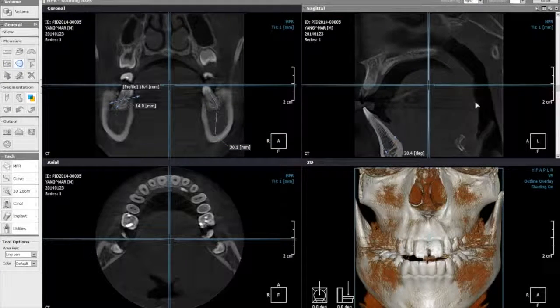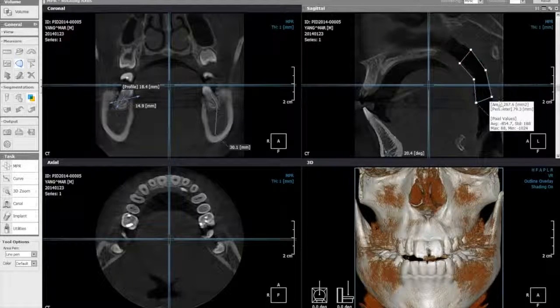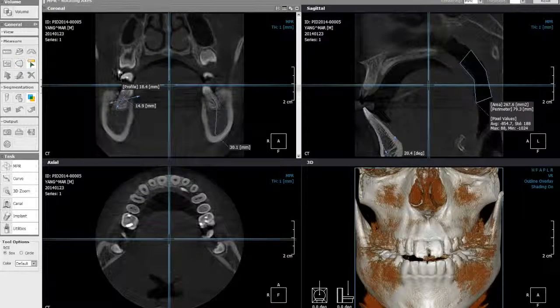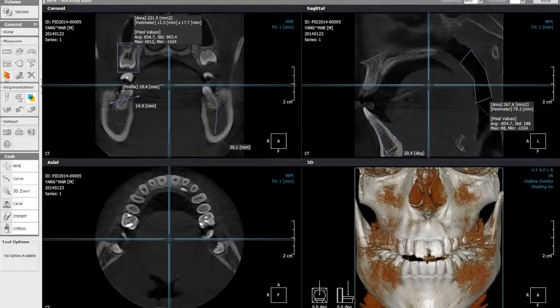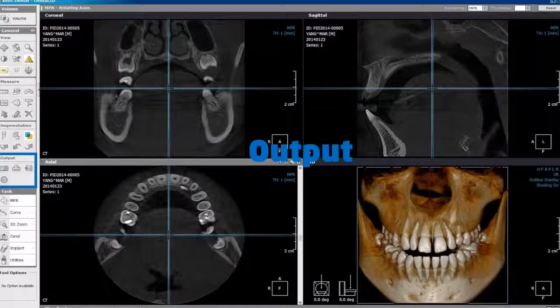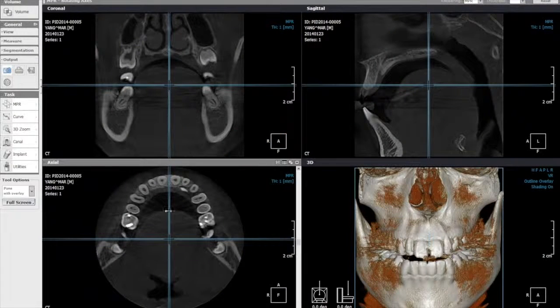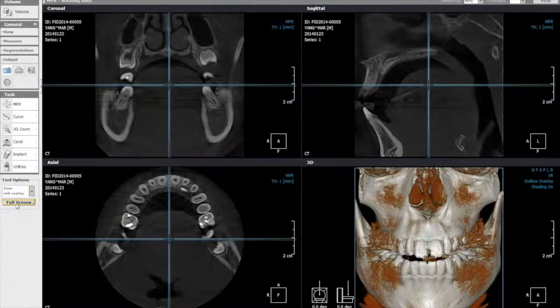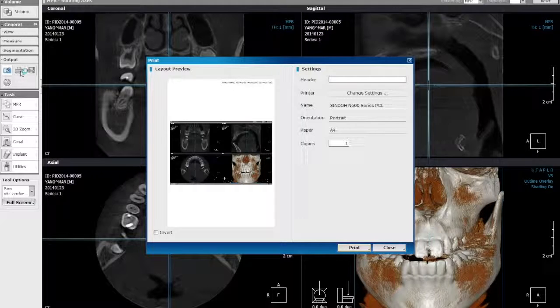You can do measurements of area — for example, if you have an airway and want to measure a specific airway amount, it will give you the area and other values. You can use the region of interest tool to specifically customize the area rather than using preset shapes. You can put an arrow and note in the image. Below that, you have output options for capturing what is on the screen, and you can update right away in SmartDent by clicking the refresh button, print a report, or save your manipulations.